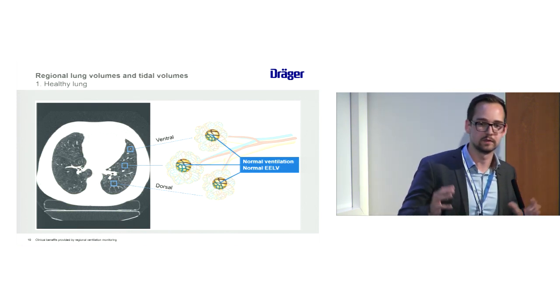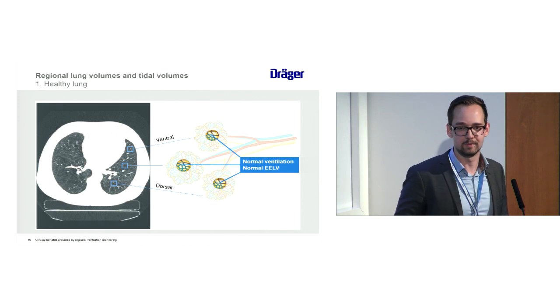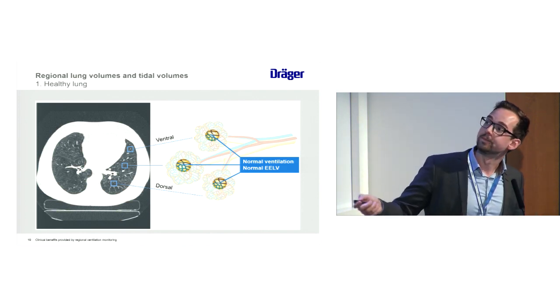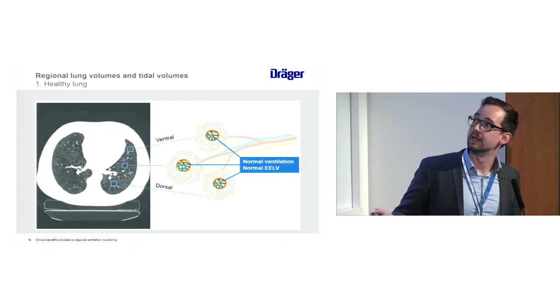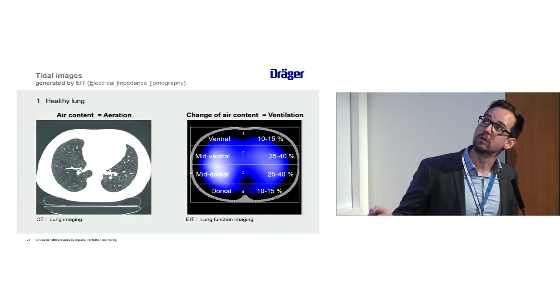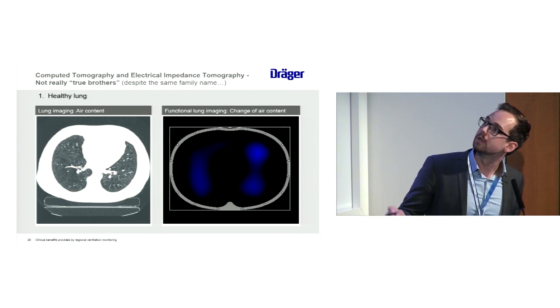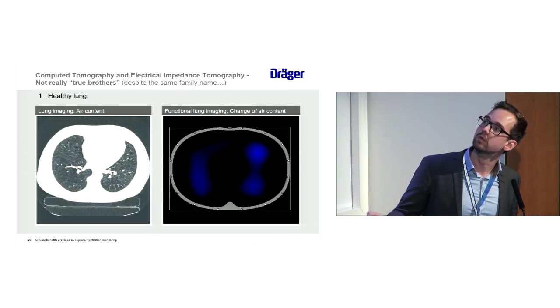I'm sorry if I have to use the balloon analogy at the moment, but it's the simplest way to truly understand the images that we're also creating. And this also can then be seen and will be reflected within our EIT image. Let me just show you. This is supposed to be moving.